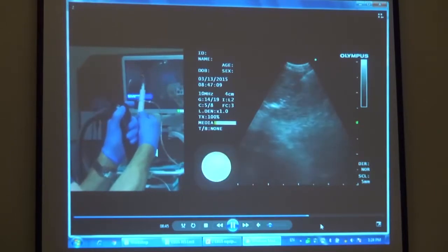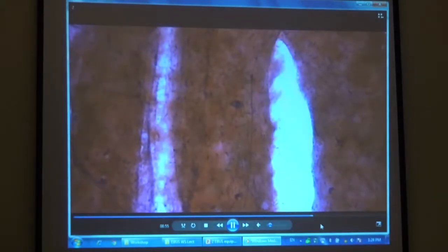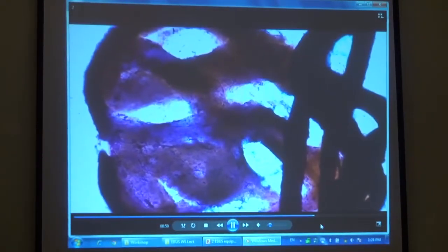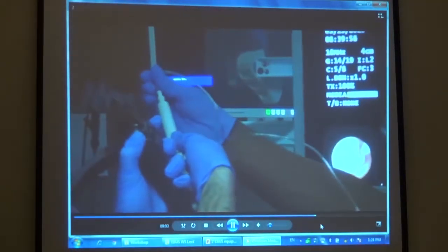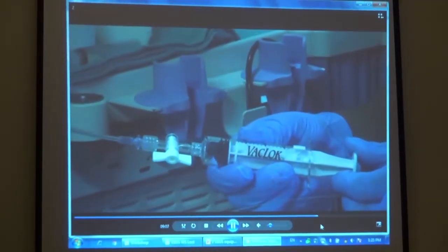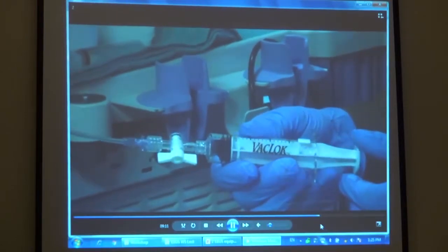Use of suction is controversial. The downside of suction is that it results in a more bloody aspirate, particularly in vascular nodes such as those in the subcarinal space. The more blood in the aspirate, the more hemodilution there will be in lymphocytes and the more clot in the specimen, both of which hinder cytological interpretation. However, more material can be obtained using suction. For small or fibrotic nodes, it is often required. If suction is used, no more than 1 or 2 cc of negative pressure should be applied.